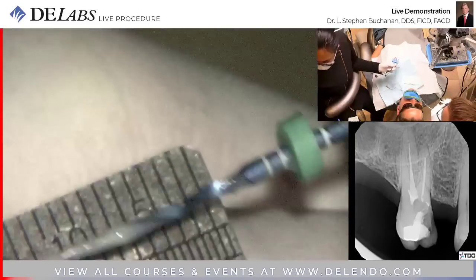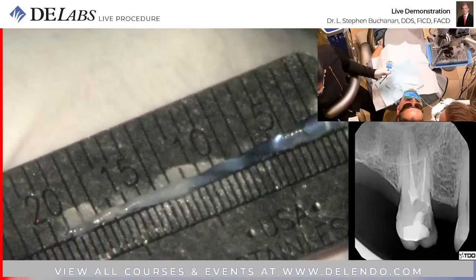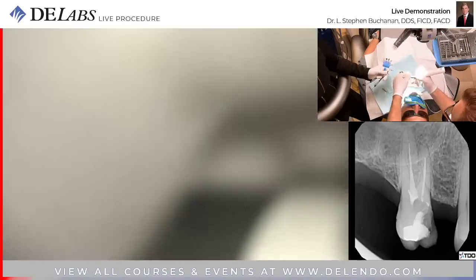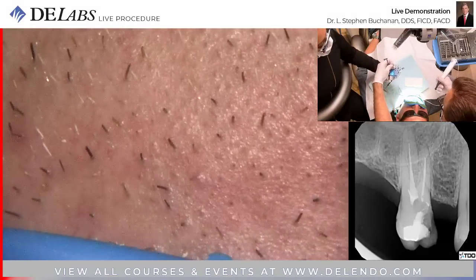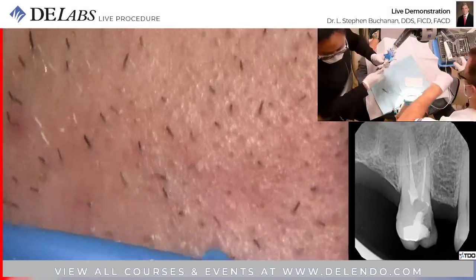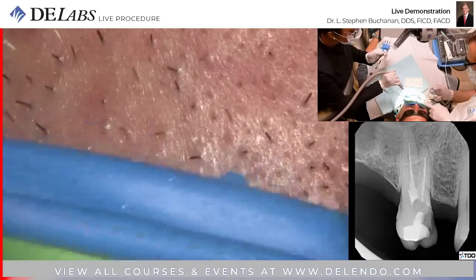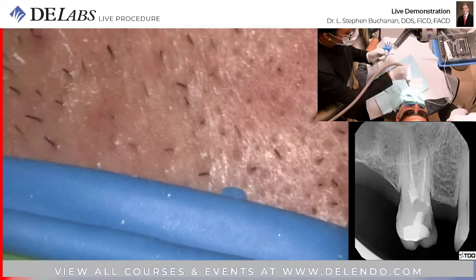MB2 length from the palatal cusp tip: 19.5 millimeters. Okay. Let's wash, irrigate. I'm going to leave that on for the shaping files. I think it'd be fun to use them. Okay, we're going to use EDTA solution.